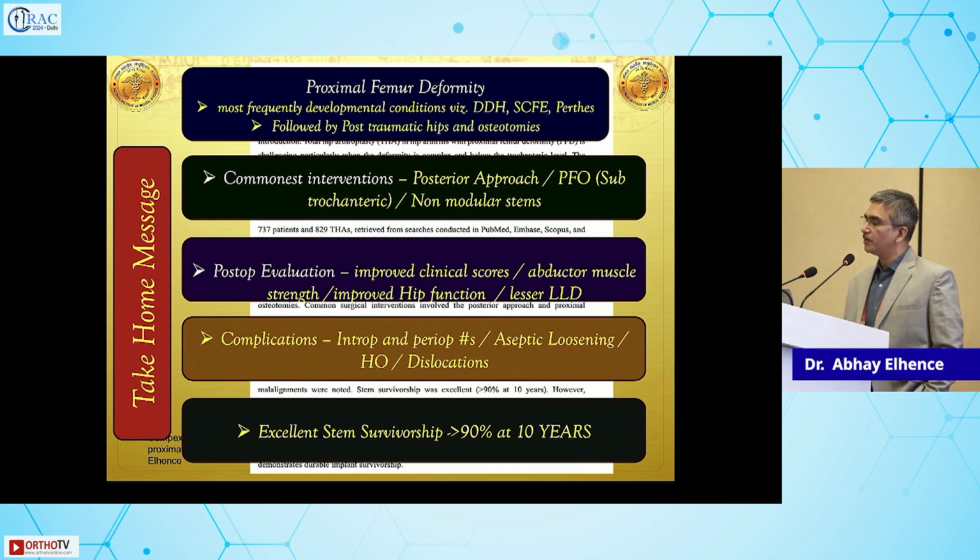Pre-op and post-op evaluation is very, very important. The more time you spend on the drawing board, the better reconstruction you will be able to give your patient. And modular and non-modular stems both have excellent survivorship, and they are wonderful reconstruction options in difficult situations.